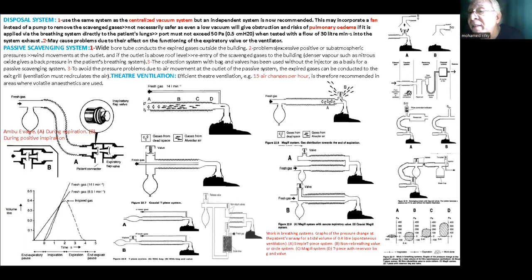Of course, as we can see, the tubing has to have around 30 millimeter diameter, and there is a male and a female connection to assure that there is no dislodgement. And this system reservoir is a cylinder which has an air leak, so it will not reflect back to the patient either positively or causing negative pressure on the patient.